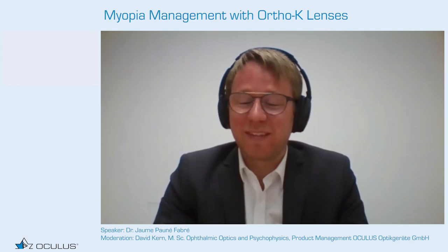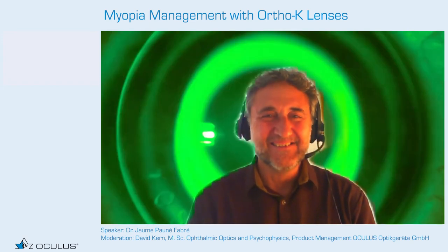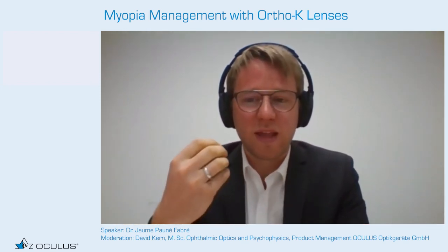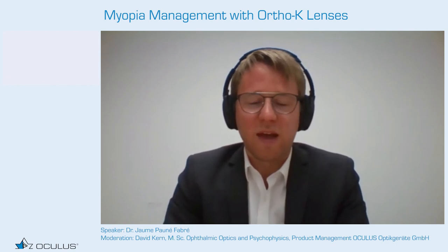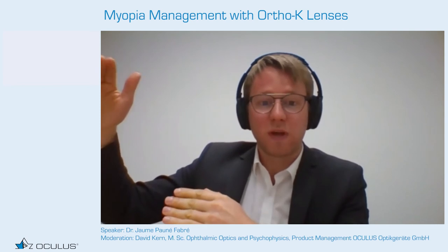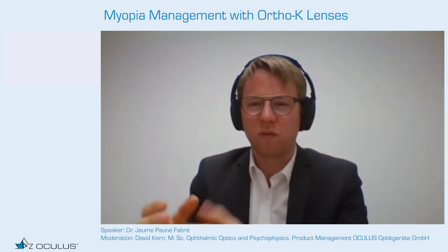Yeah. Sorry, David. This is a very good comment, because this is exactly what people are asking. But maybe I can also give an answer here. Jaume, you showed us that the difference between children is pretty large: for some it works very well, for some it doesn't work so well. So what we always have in mind is that even if we show something with a Myopia Master, the average, as you also showed in your slides, might be totally wrong, because treatments sometimes work much better, sometimes much worse.